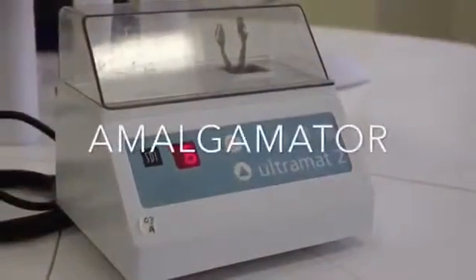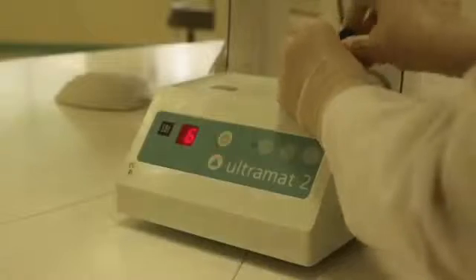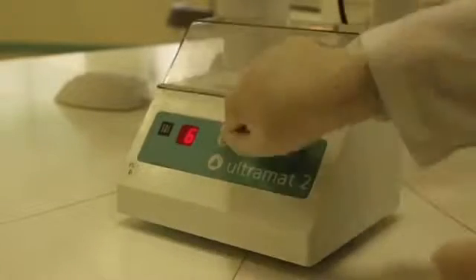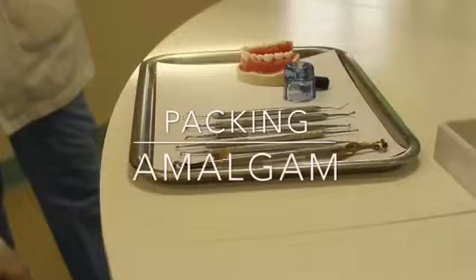Of course, we're going to need amalgam and a machine that mixes amalgam called an amalgamator. We're going to put the amalgam capsules into the amalgamator for 6 seconds, or according to manufacturer instructions. After 6 seconds, remove the amalgam capsule. Now we're ready to pack the amalgam into the preparation.